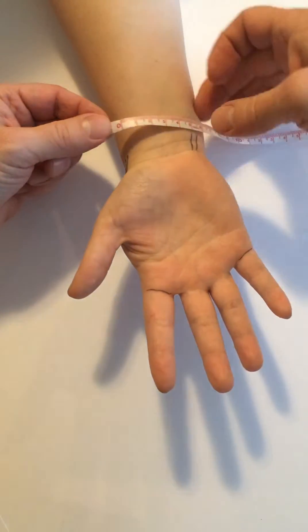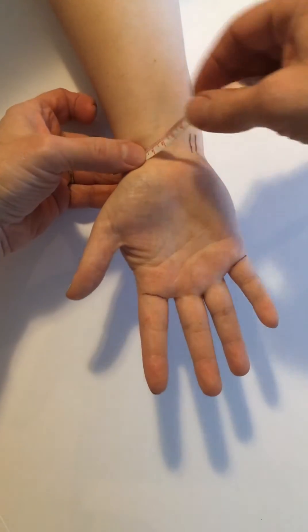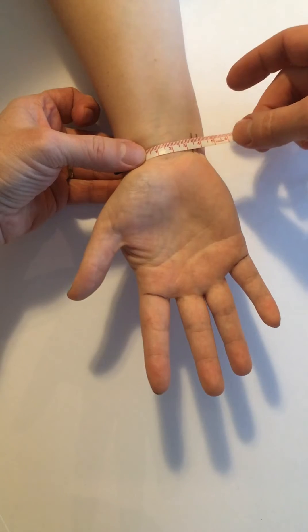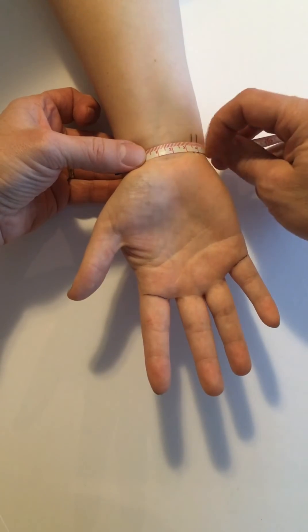So it looks like it's this guy right along here. We're just going to set that down about there and then from the radial aspect go ulnarly, again staying just proximal to that distal wrist crease with our tape.